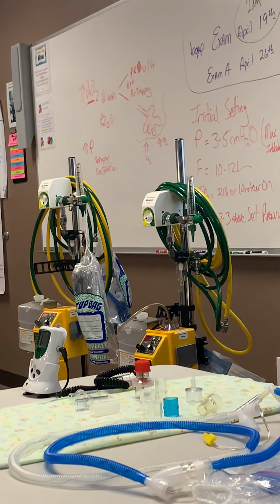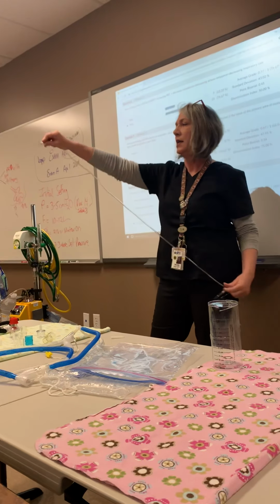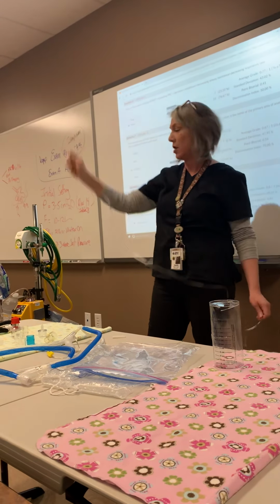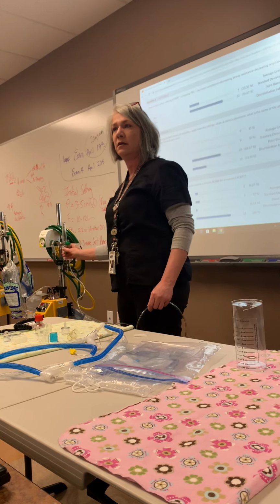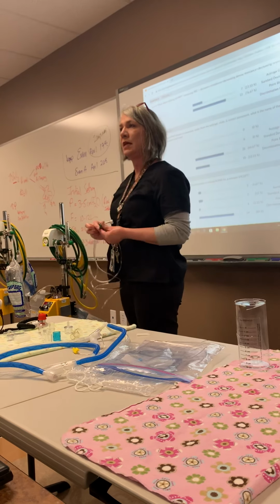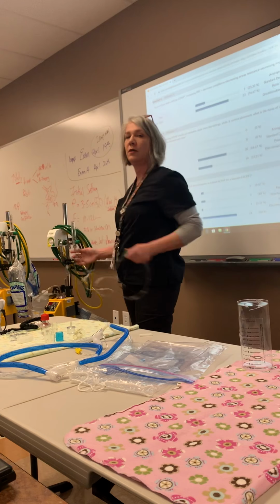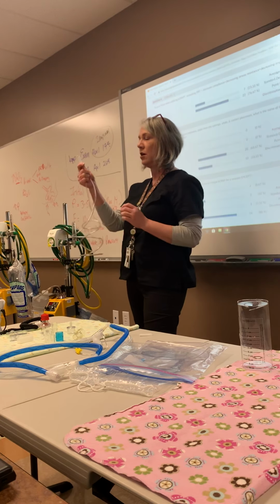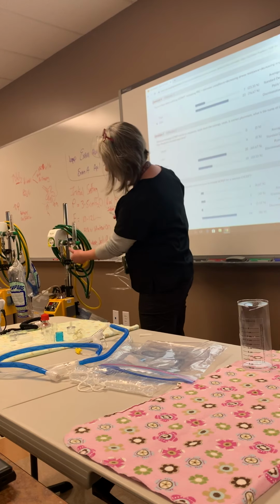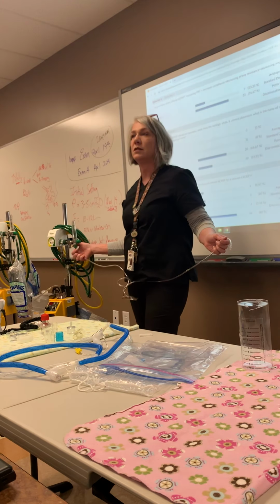Right? This one is unique in that a lot of facilities are going to this. I like it. It already has the screw adapter, so I don't technically need the Christmas tree. So if I didn't have it, I would not be remiss, because this goes right on here beautifully. But if you have the older O2 tubing that has just this unit on both sides, then I do need the Christmas tree. And then I connect it. I can also connect this side right onto the Christmas tree.